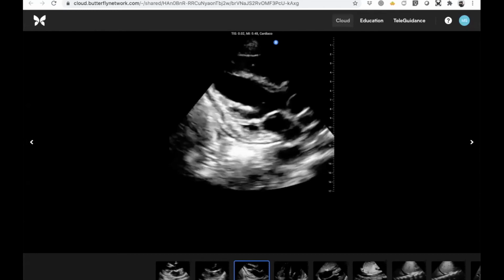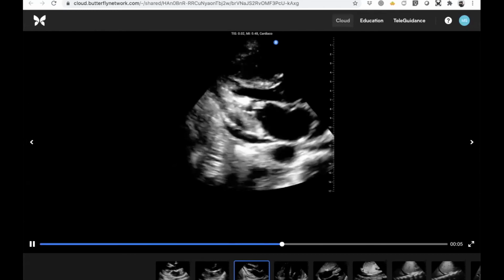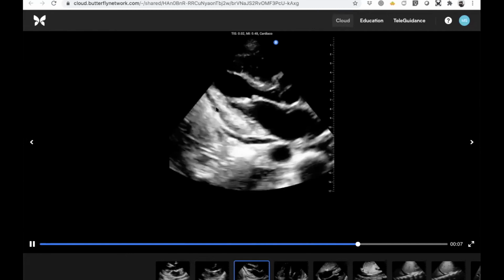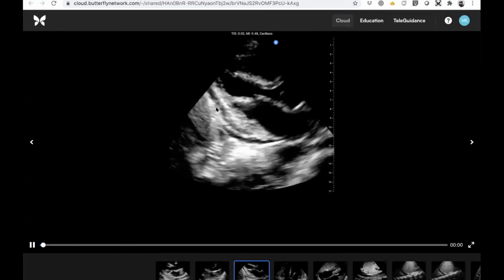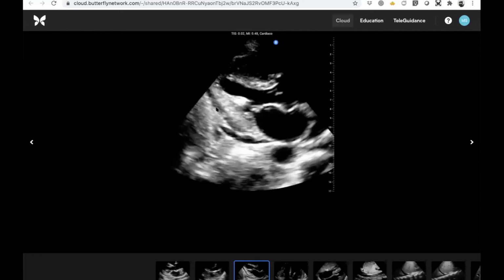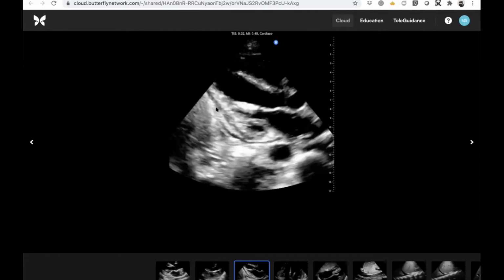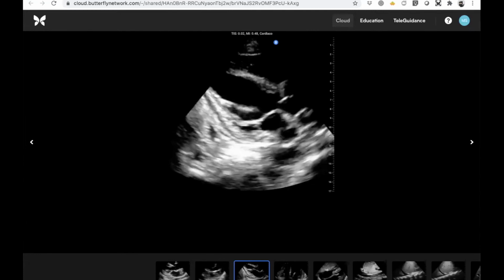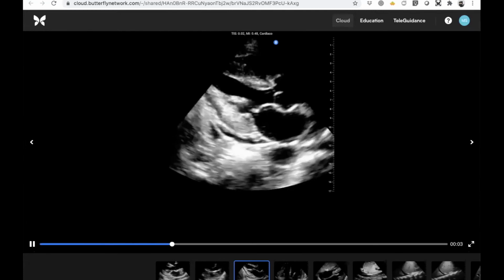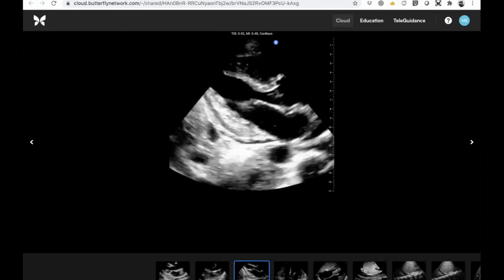So there is some imaging debate about which way the LV apex should be oriented, and whether this should be flipped mirror image in emergency medicine versus cardiology. And Rachel and Chris at Yale have had long, interesting, and well thought out arguments to put the apex of the heart on this side and the directional indicator on this side. We're not going to cover that today because that would be a 2-hour webinar.